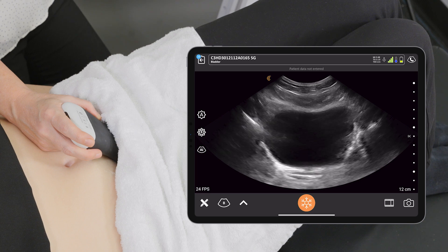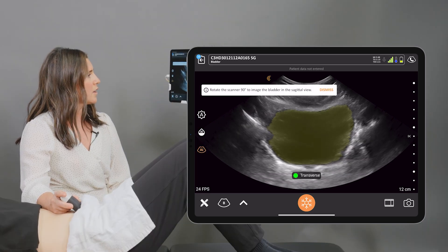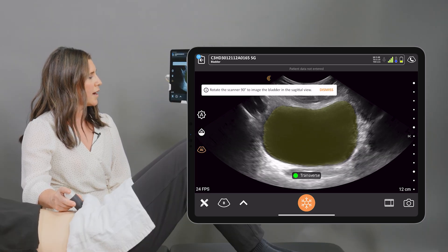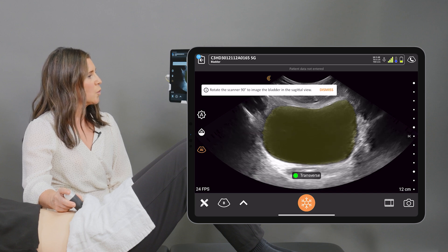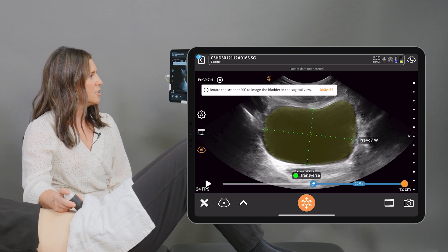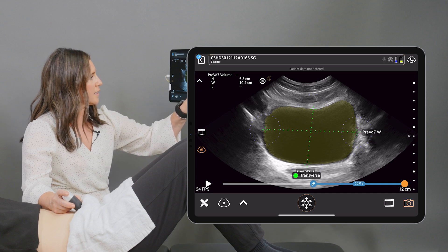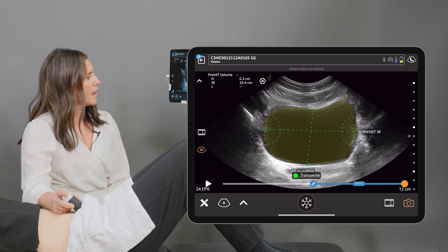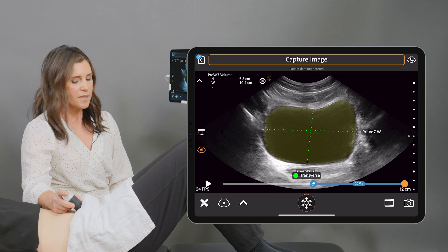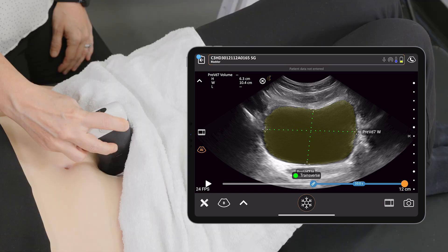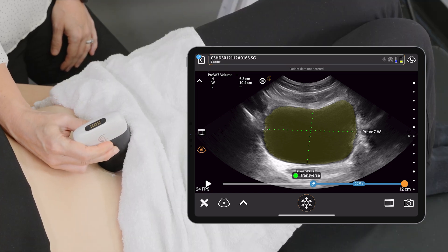We're also going to use the bladder AI function, so that brings that up there. Getting a clear image, we're going to freeze the image. We're going to adjust the calipers slightly here and then capture the image. Then we're going to rotate the probe sagittally so that the marker is up towards the client's head.